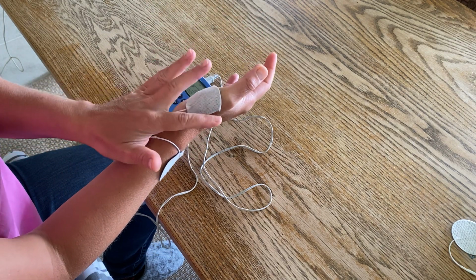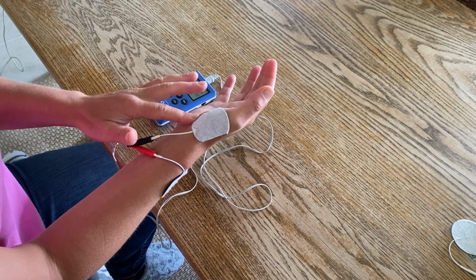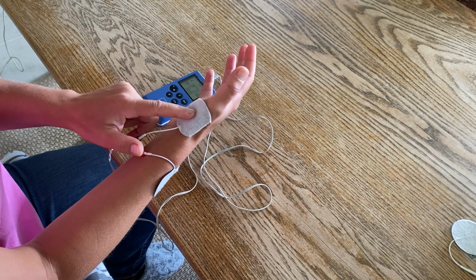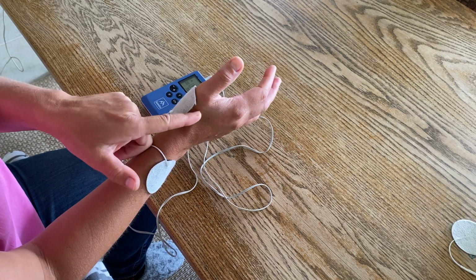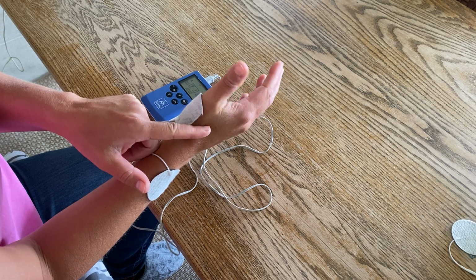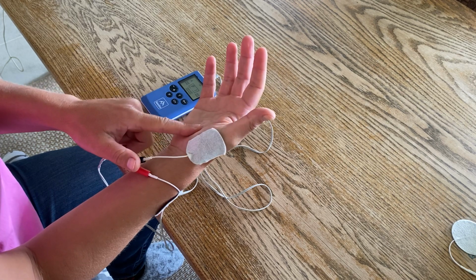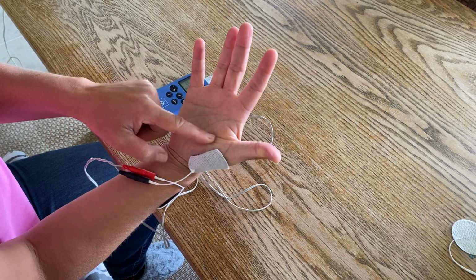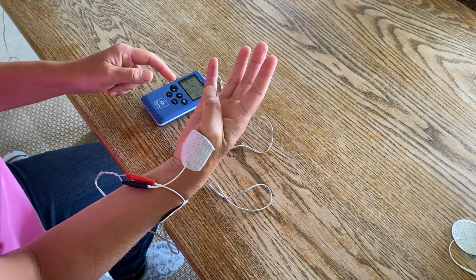So you'll notice that mine has got the edges cut off, and the reason being the electrode will stimulate any muscle underneath it, and if it stimulates here or underneath here, I'll get different movement because there's a lot of different muscles running through the thumb. So too much over here, my thumb will go there. Too much down here, my thumb will just pull in.